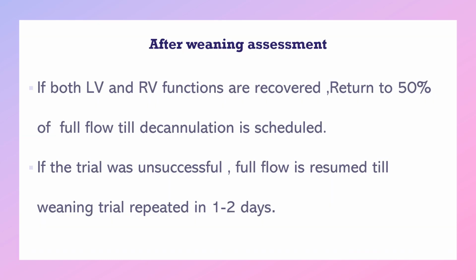After weaning assessment, if both the left ventricle and the right ventricle have recovered, we can return to 50% of full flow until decannulation is scheduled. If the trial was unsuccessful, full flow is resumed until the weaning trial is repeated in 1 to 2 days.